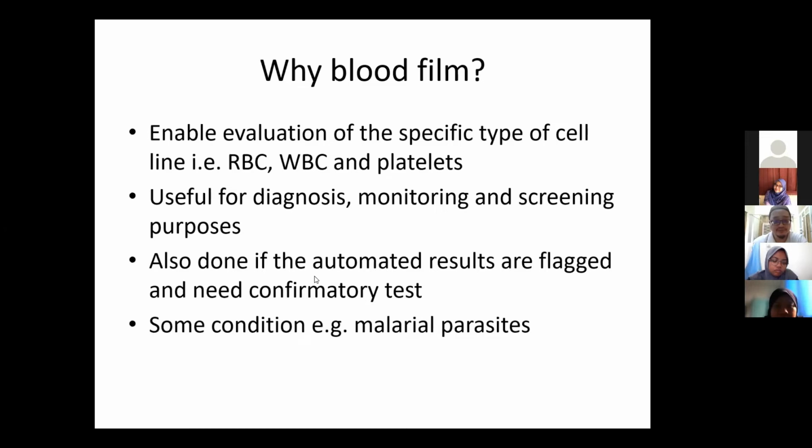So it is useful for diagnosis, useful for monitoring, as well as screening purposes. And there are also conditions where a smear is very much obligatory to reach a diagnosis, like malaria. We can see whether it's the early stage or end stage malaria, because we can see the parasite clearly. That cannot be done by the machine.